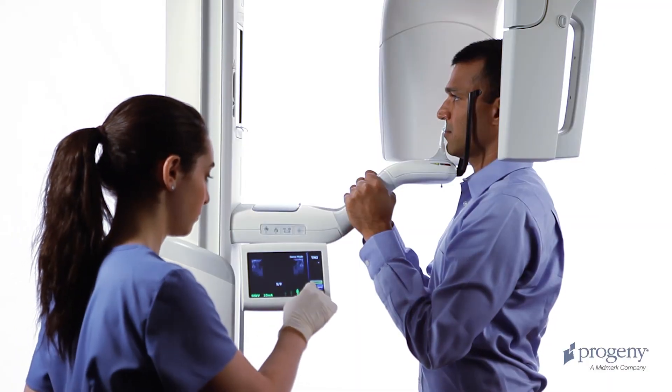Ask the patient to fully open the mouth, remain still, and hold their breath for the duration of the scan. Perform the second scan of the TMJ examination.